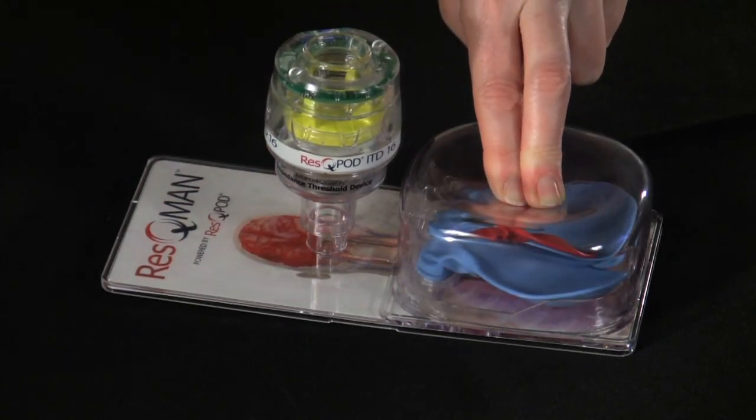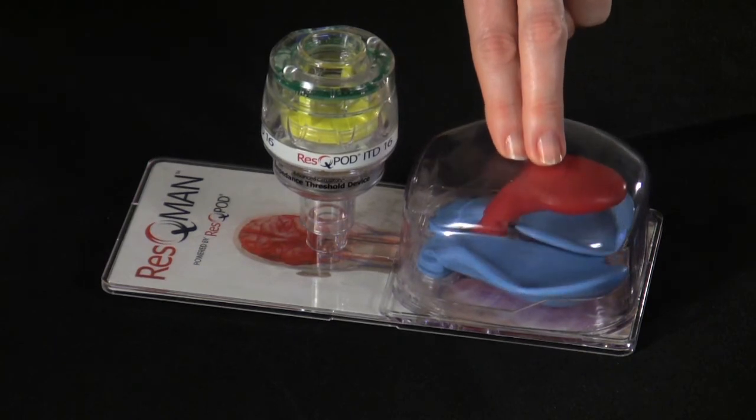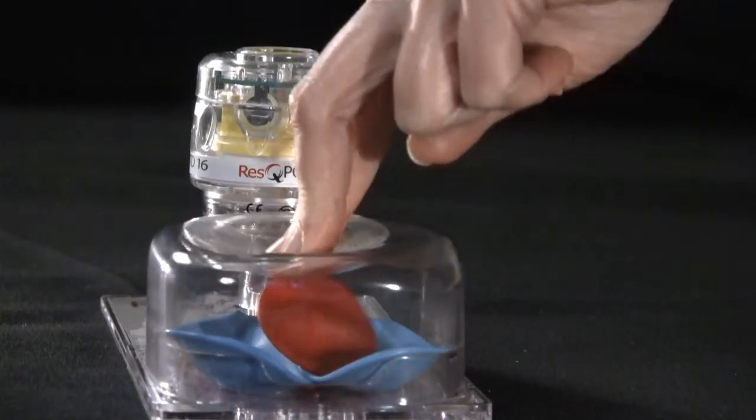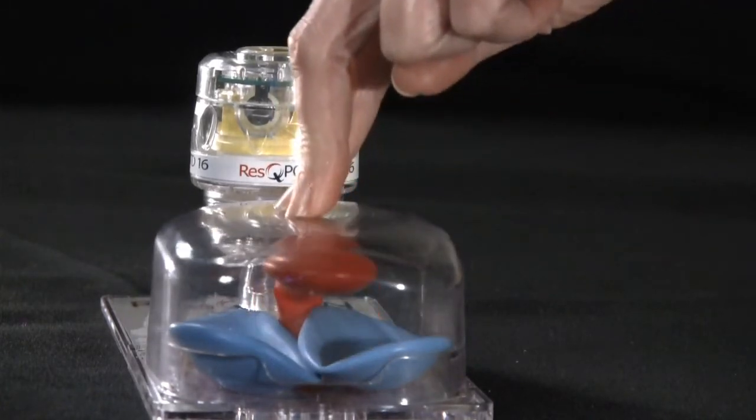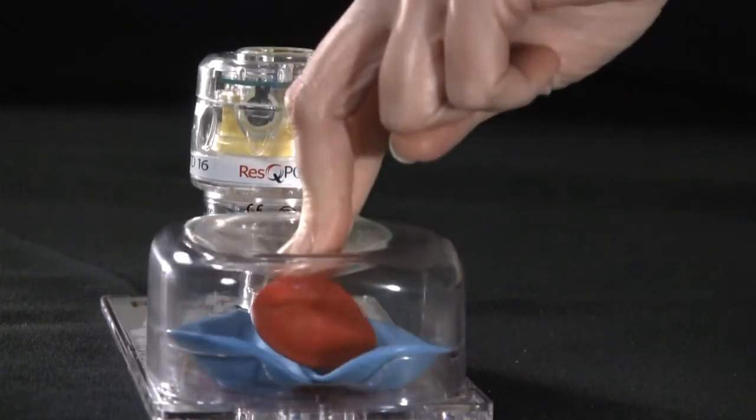but closes during the recoil phase. This significantly enhances the vacuum that we create during chest wall recoil and doubles the amount of blood pulled back to the heart.